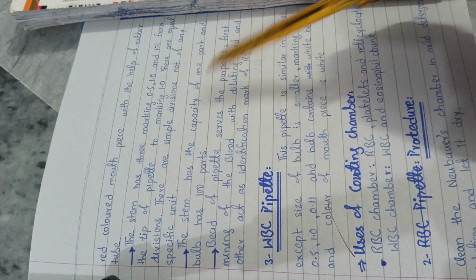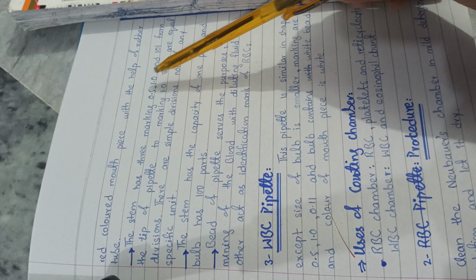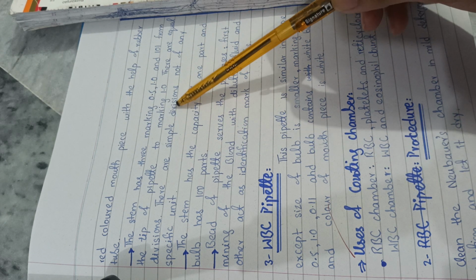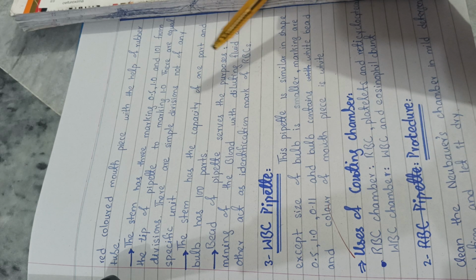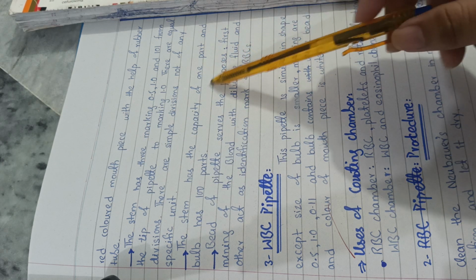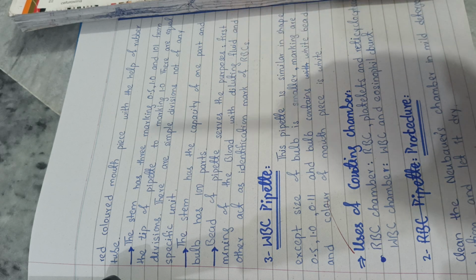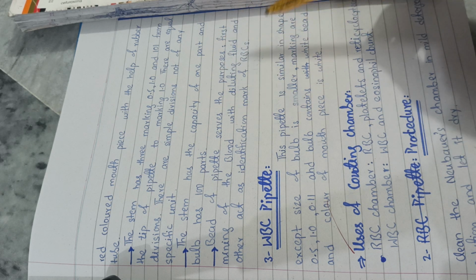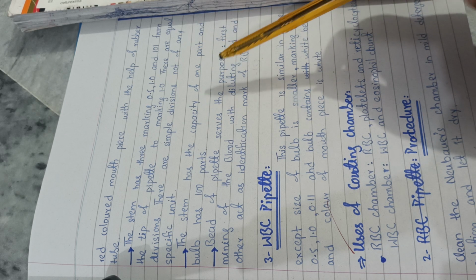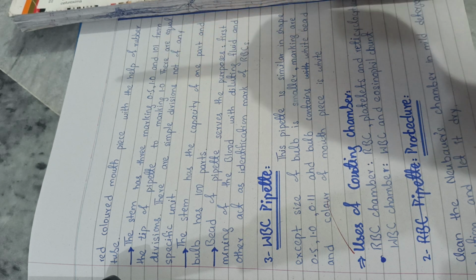The capillary stem of this pipette has some readings, for example 0.5, 1.0, and 101. These readings are useful for measuring the blood and diluting fluid. The stem is divided into two readings, 0.5 and 1.0. Then the bulb portion of the red blood cell pipette consists of 100 units, so after the 1.0 reading, the reading of 101 comes.